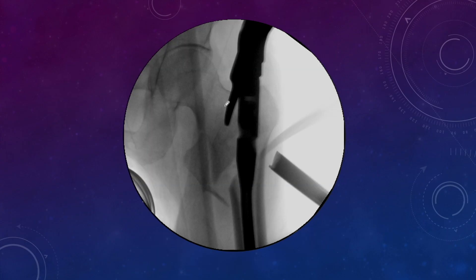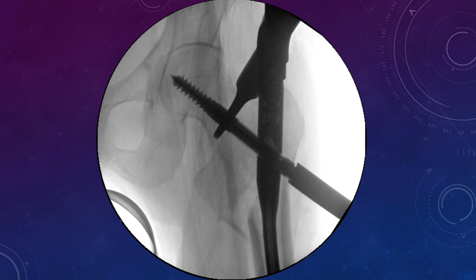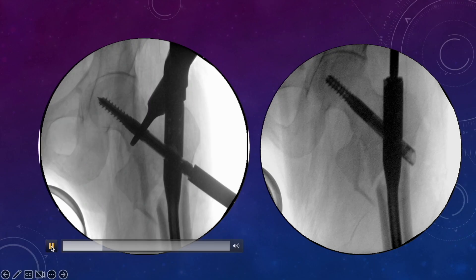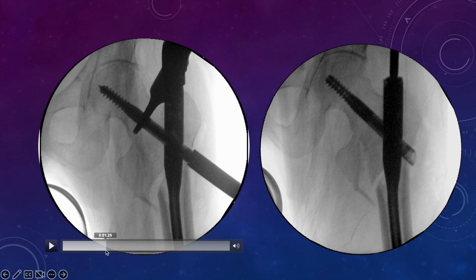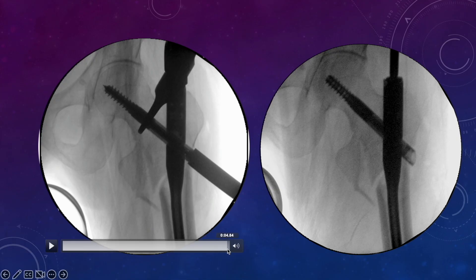Now a second example. Here the surgeon had tried to gain a positive cortex, but the fracture is still distracted. In lateral view it is aligned, but he placed the guide wire in this position without releasing the traction at this point. Even in this distracted position he placed the guide wire and then inserted the screw. Now he tries to gain compression at the fracture site — watch carefully. This fracture is distracted here, and after gaining compression, it is getting compressed step by step. Ultimately this is a good thing — the cortex here is positive and the fracture gap is minimal.